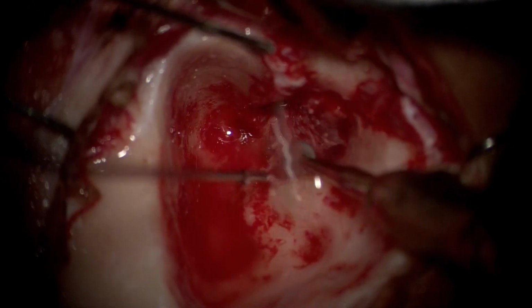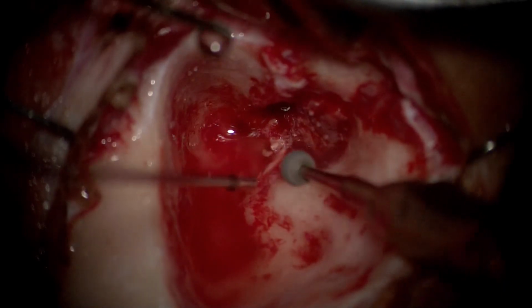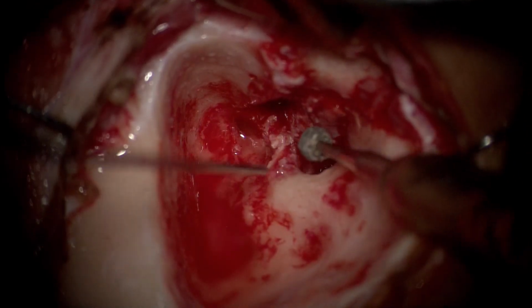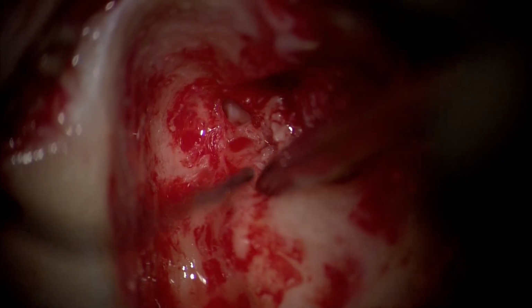Very often people call this recurrent cholesteatoma, though there's hardly anything called recurrent. Mostly it is residual cholesteatoma. Recurrent is only in the long term, if you have had some patent deep recesses in the drilled mastoid where epithelium starts to collect again, and that could truly become a recurrent cholesteatoma. Otherwise, mostly it could be residual disease.